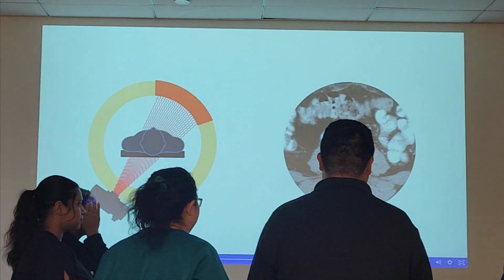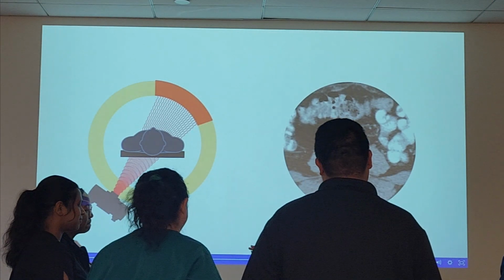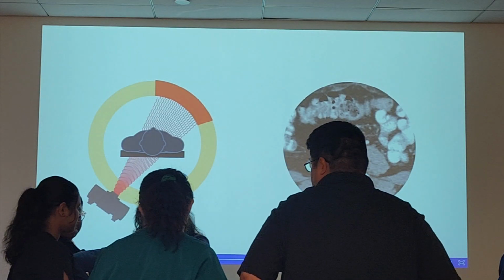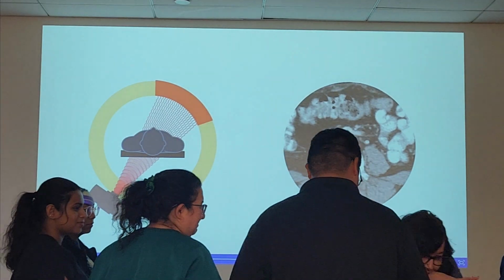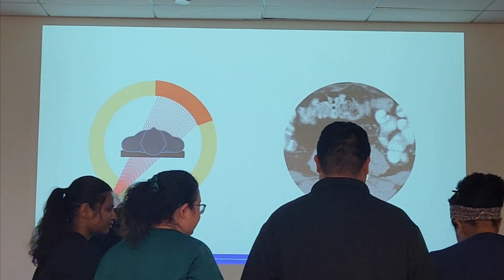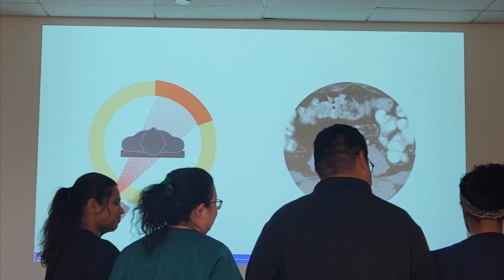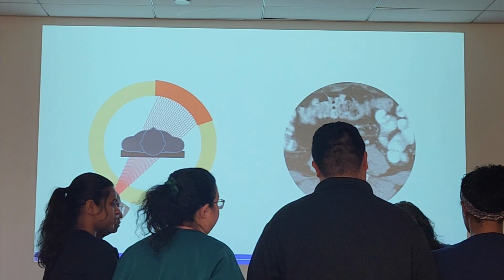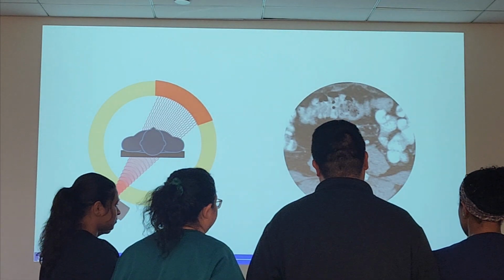All right. Okay, I'm an X-ray beam. I'm gonna pass through you. Some of this is gonna get absorbed, and some of it is not. X-ray beam goes through you. Less gets to the detector. Most of it gets scattered. Oh, nothing got to the detector because it got scattered or it got absorbed.